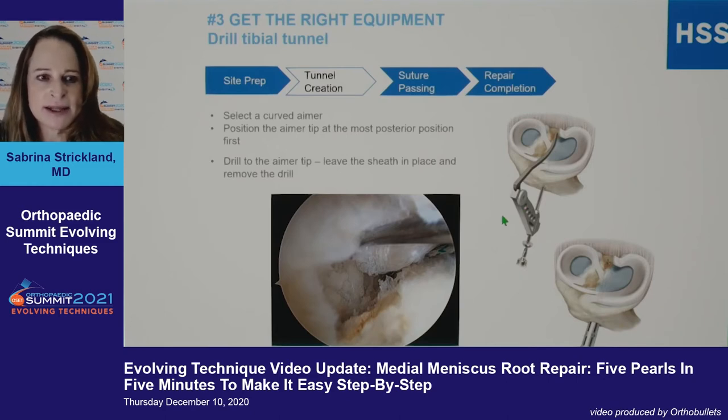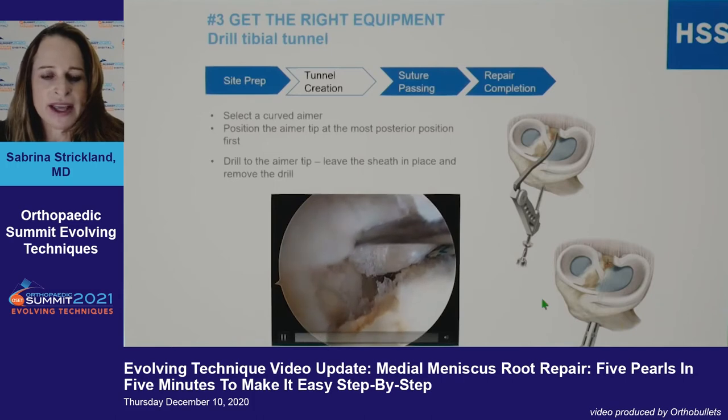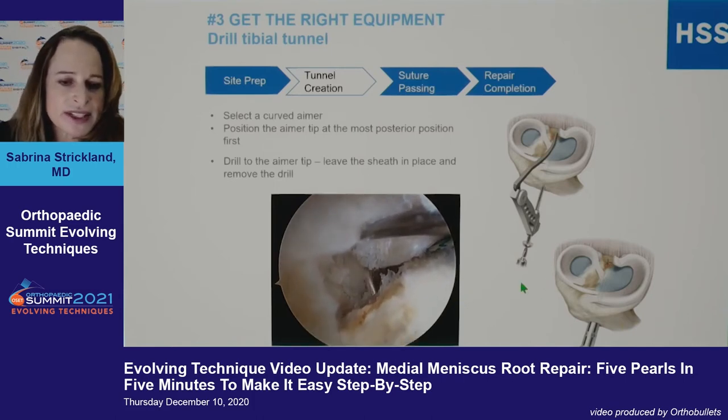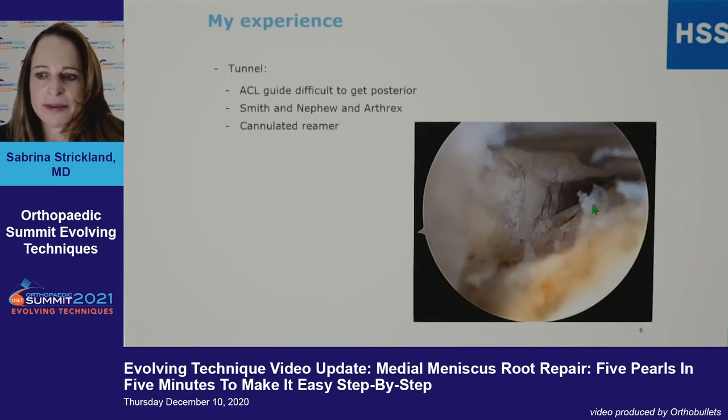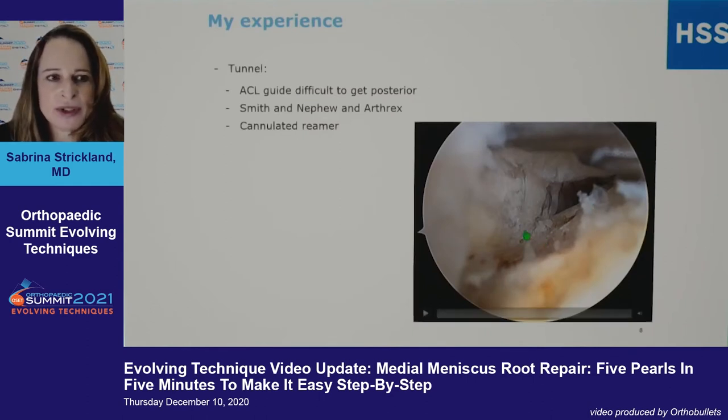Multiple companies make specialized root repair systems, and multiple companies also make an aimer pin with a sheath — Arthrex, Smith & Nephew, and others — so that you can drill and be able to see what you're doing. Here you can see the cannulated tip coming through, which allows you to pass a suture. A cannulated reamer makes getting posterior much easier than the ACL guide.